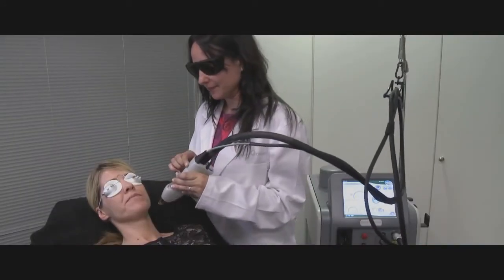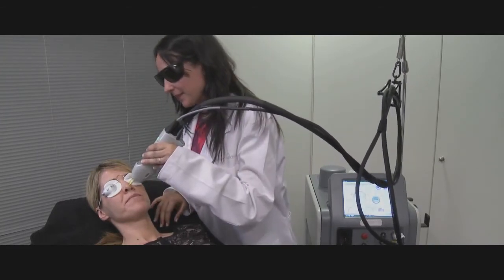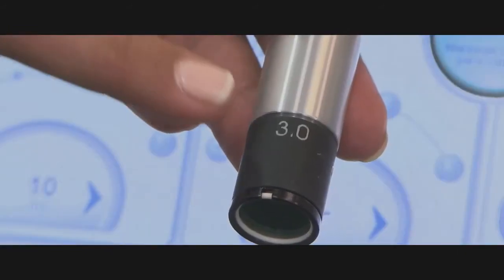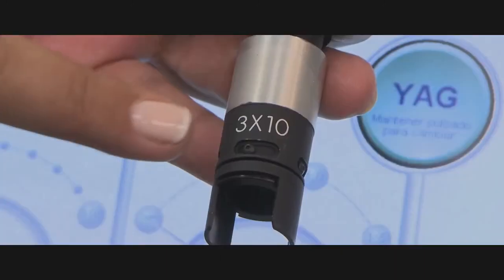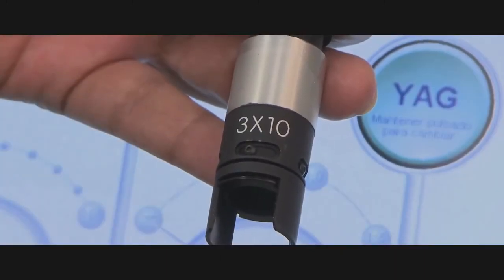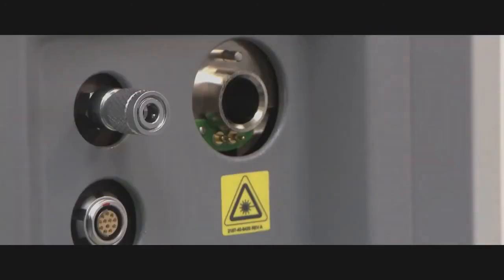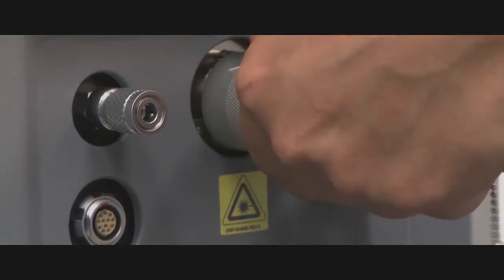Vascular treatments are done using 3 different spot sizes: 1.5 millimeters for facial and leg vessels, 3 millimeters for leg vessels, and the 3 by 10 millimeter elliptical spot for leg vessels. The vascular specialty delivery system must be attached to the device.